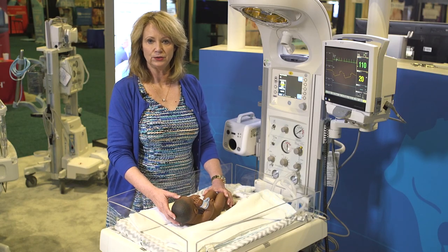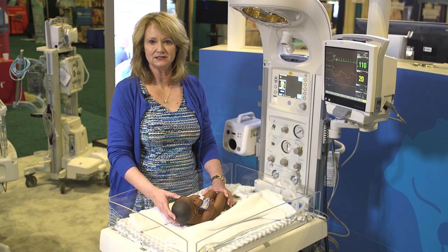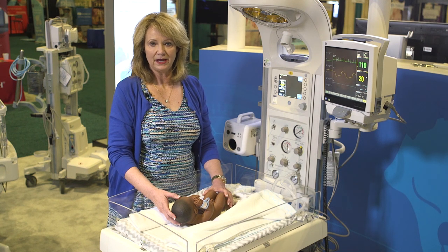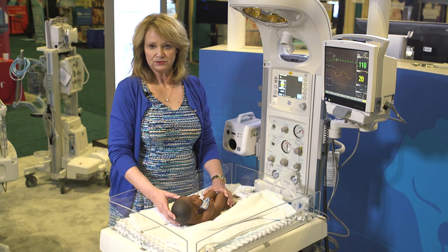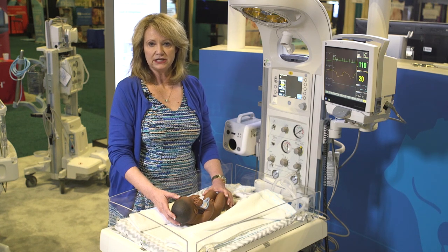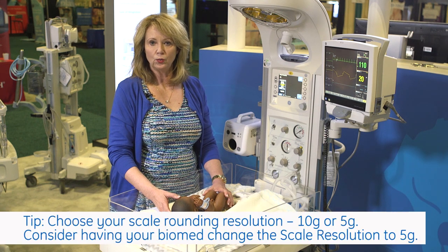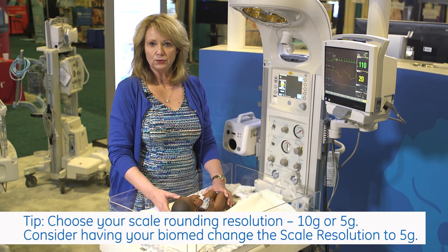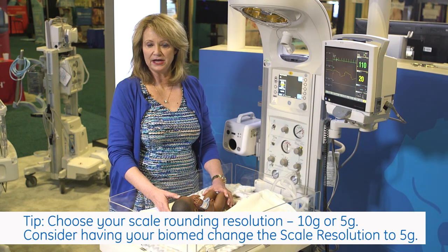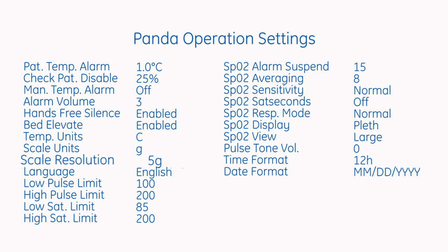One last tip for obtaining consistent weights with the Panda Warmer: when you receive your bed and it is shipped to your hospital, it will be set or defaulted to a 10-gram rounding for your weights. Many of you choose to decrease that 10-gram rounding to 5 grams. You may want to be consistent with either the 10-gram or 5-gram rounding so that you are getting those consistent weights.